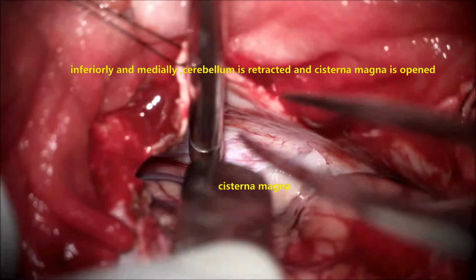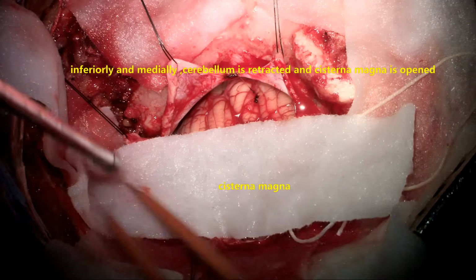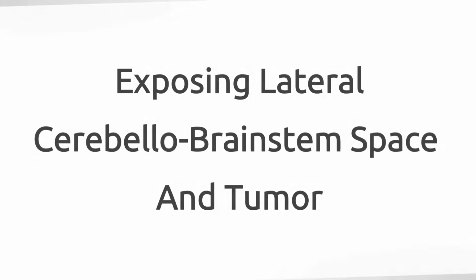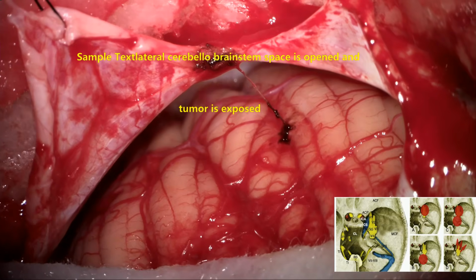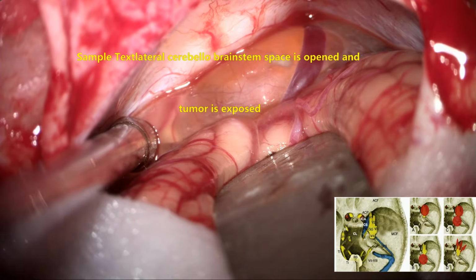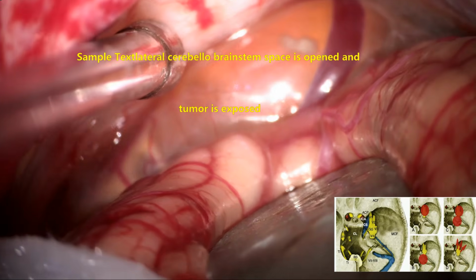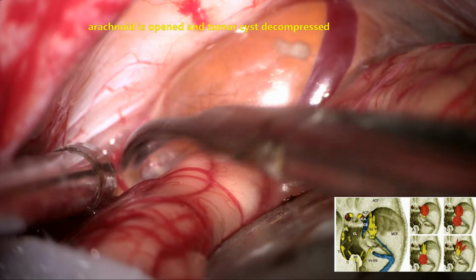One is superior and one inferior. Both are opened and CSF is let out. You can see now the cerebellum becomes lax and pulsating. Once that is done, now you see the cerebellum is very lax. Gently, the cerebellum is retracted and the cystic component of the tumor is exposed.